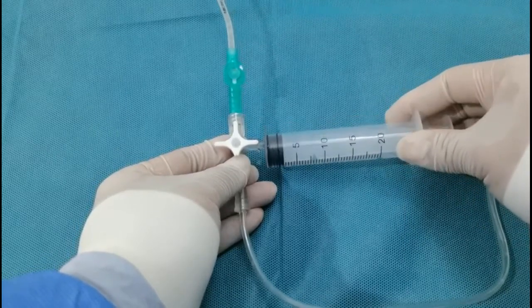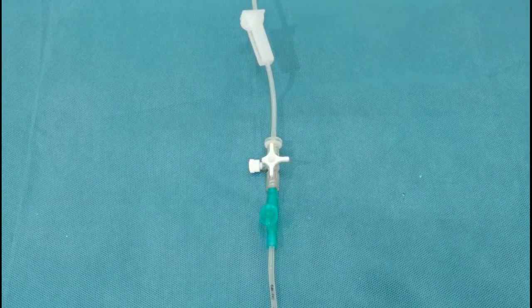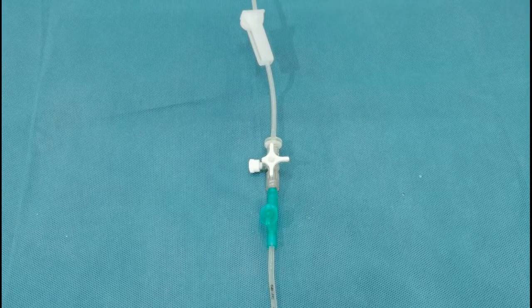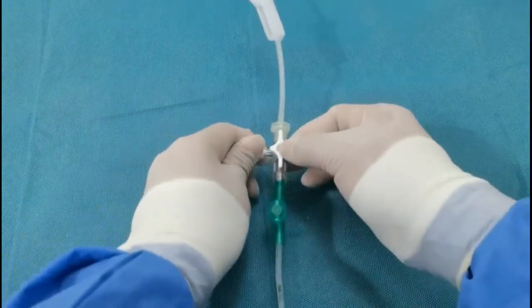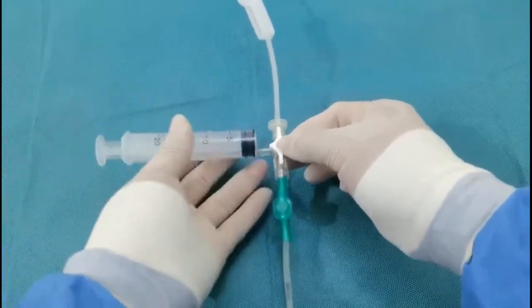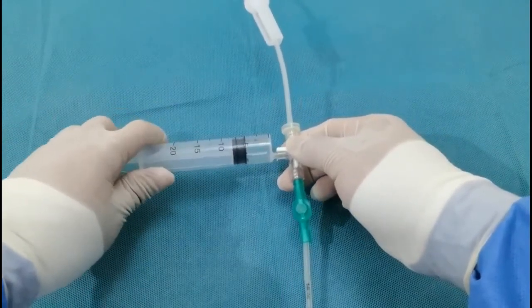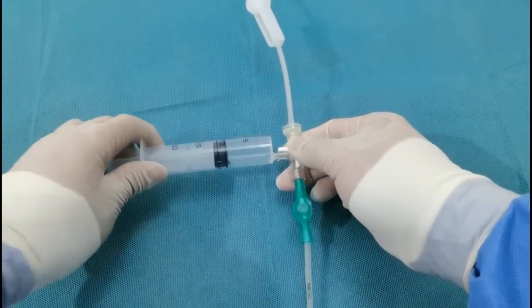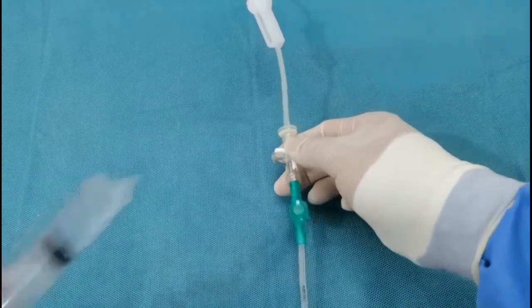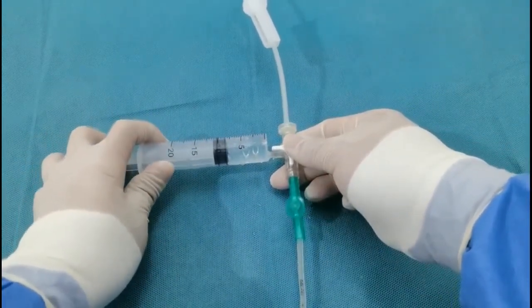When the outflow tube is blocked, causing fluid in the joint cavity to stop flowing, the inflow tube is also prone to blockage. The blockage in the inflow tube can be cleared in the same way as a blockage in the outflow tube. The cause of blockage can be easily and clearly determined by the three-way stopcocks connected to the inflow and outflow tubes. If no resistance is felt while injecting saline, one should consider other causes such as folding and twisting of the tube, the wrong irrigation speed, or the improper suspension height of the sodium chloride irrigate.